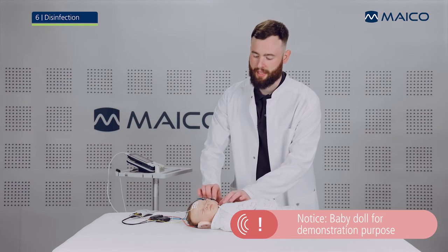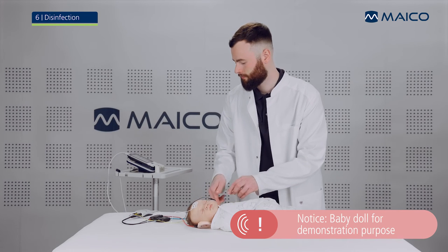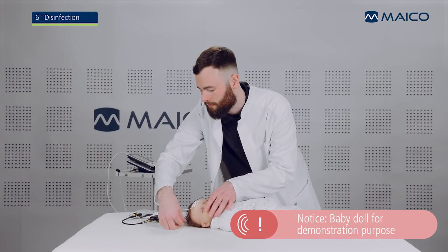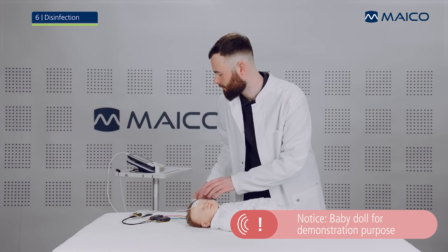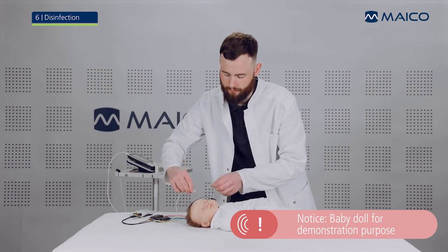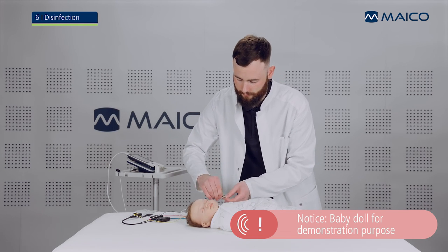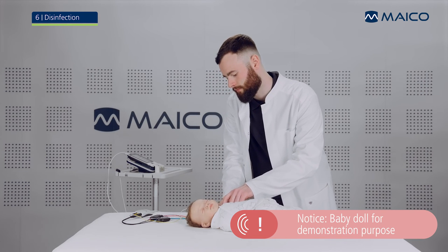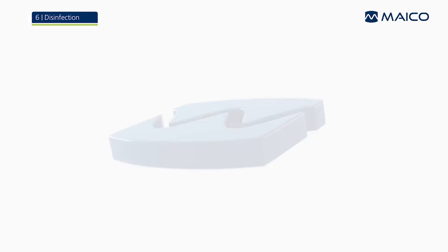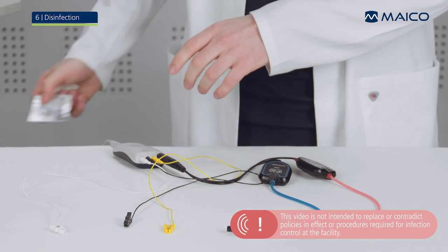Gently remove the ear cups and the disposable electrodes from the baby. Then disinfect all parts as described in the operation manual before use on the next baby.